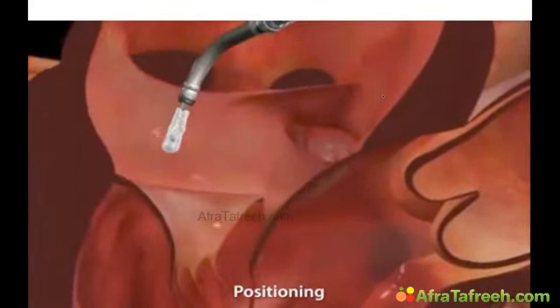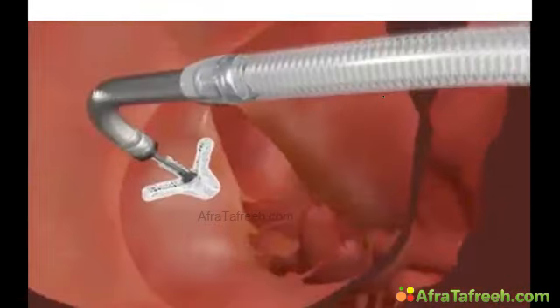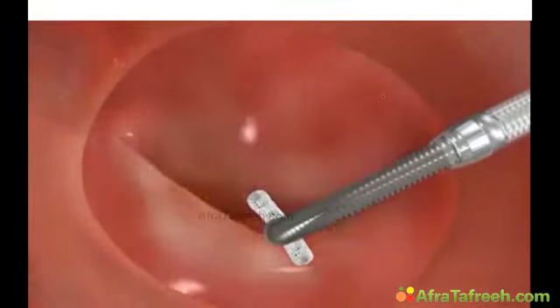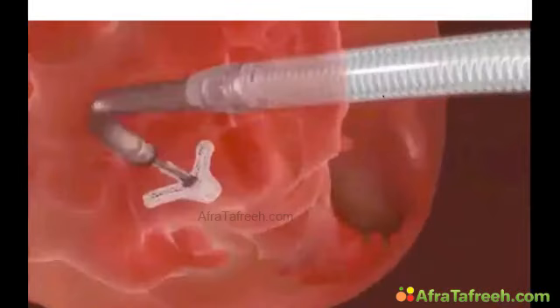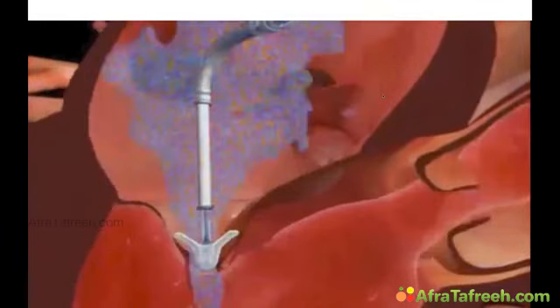You need TEE because only there can you see the valve, because you have to know where the valve is. So then you open up this clip, and you try to see if you have a perpendicular orientation to the valve. You play around with that, and then in essence you simply try to find where the maximum jet is, and that's where you go into the valve.